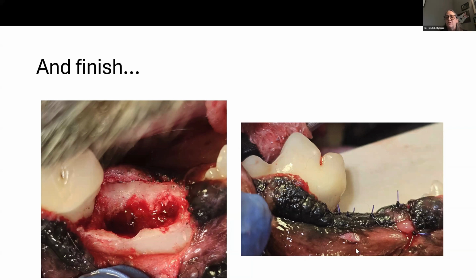And now with my suture, although I have a slight mucosal tear, do you see where the attached gingiva is now lower on this tooth, directly over the bone? Well, we had lower bone levels. Yes, we have root exposure, but we're not going to have a pocket. We're going to have a much healthier situation. Even though we've got periodontal disease with attachment loss, we're not going to have that deep pocket anymore on that adjacent tooth. Home care is possible, additional care is possible. So I will do more around those important teeth to keep them healthier.